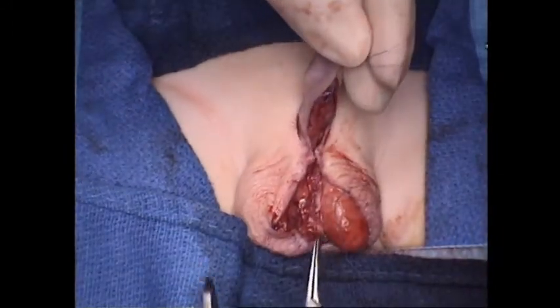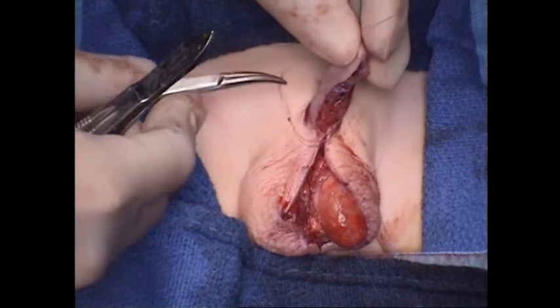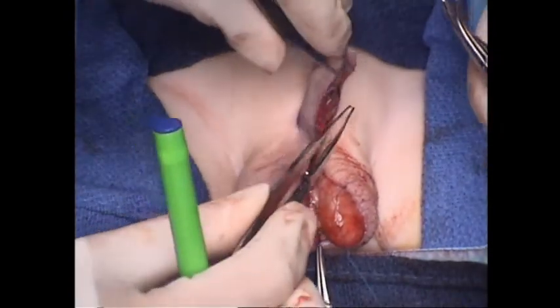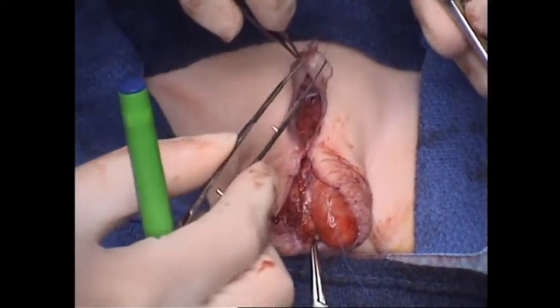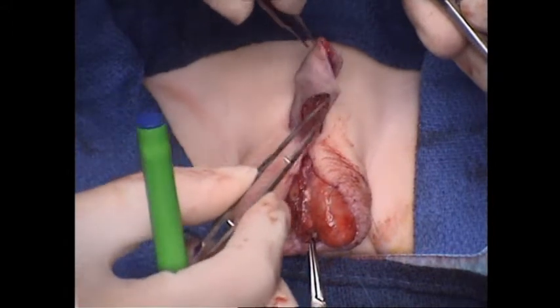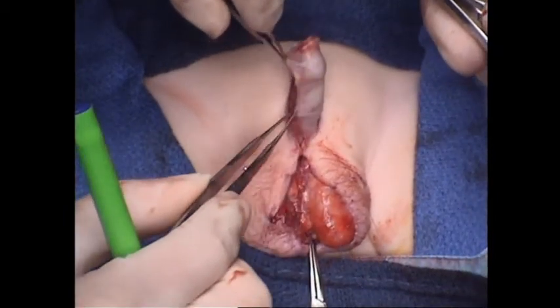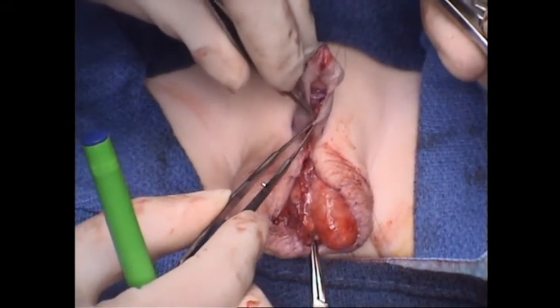So you can see why we put this stay suture here. We again want to pull that down and not allow this to pull up and foreshorten our penile shaft skin along the ventral surface. And right here, you have to be very careful with your assistant that they're not pulling up too snugly on these edges, which will again shorten your ventral penile skin. Because you don't want to put any of this together under tension if you can help that. And then for an additional layer of protection, you can have your assistant hold here in the midline.